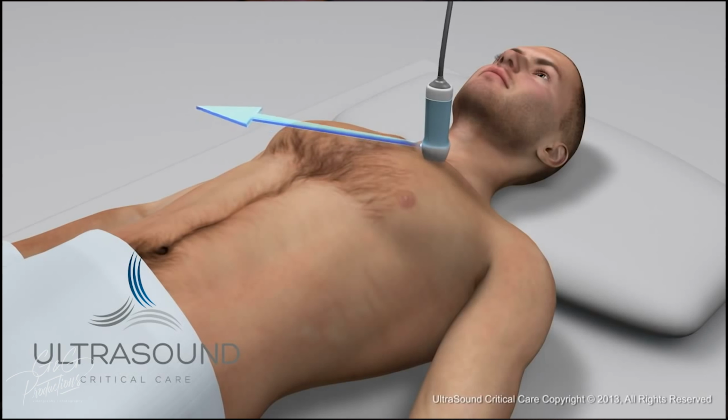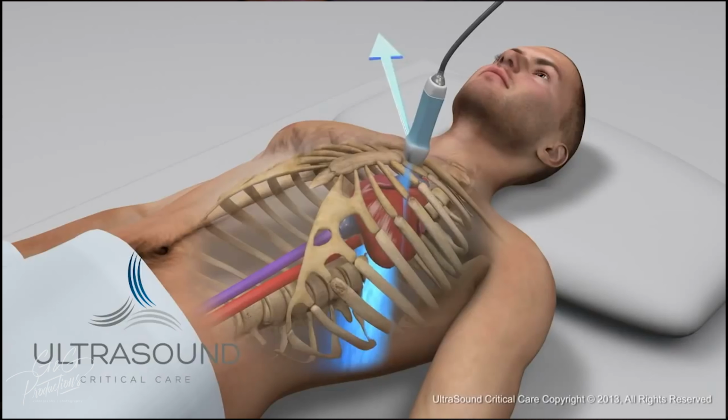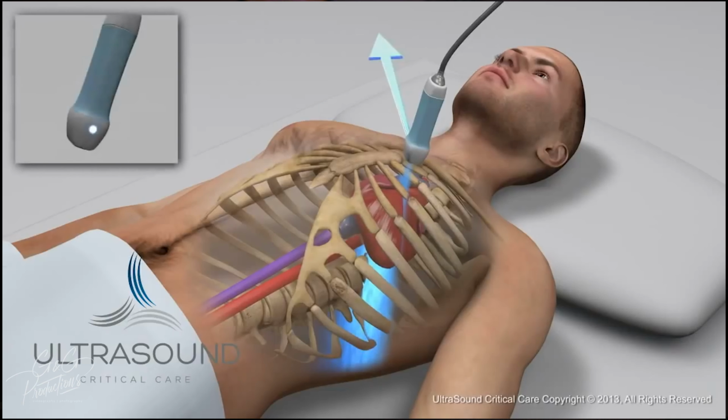Taking exams, let's start off with the PLAX exam, or the parasternal long axis exam, right? To start off with, make sure that your probe placement is where it's supposed to be. If you think of a V2 placement where you're doing your 12 lead, the most important thing to remember is that your probe marker is towards the patient's right shoulder. Otherwise, you'll get an image that makes no sense to you, or you won't know what it is that you're looking at. And you're going to be doing this at the level of the fourth intercostal space.